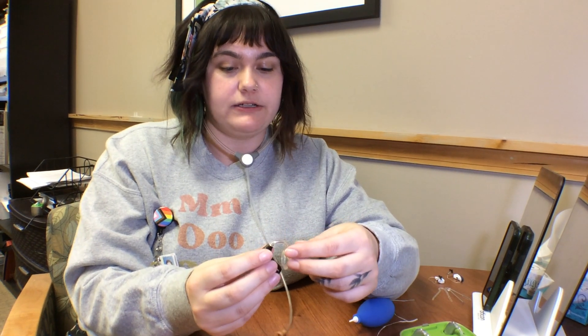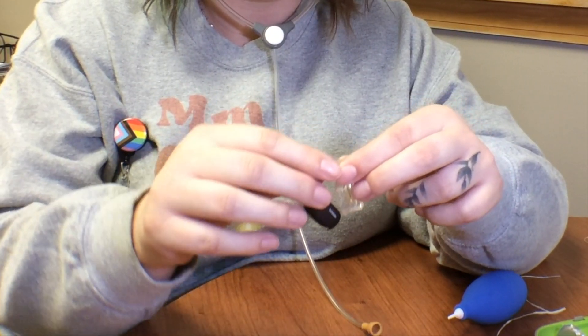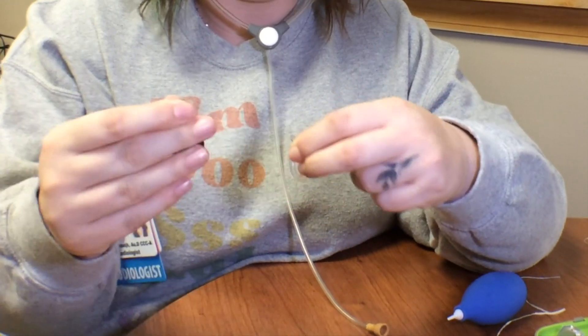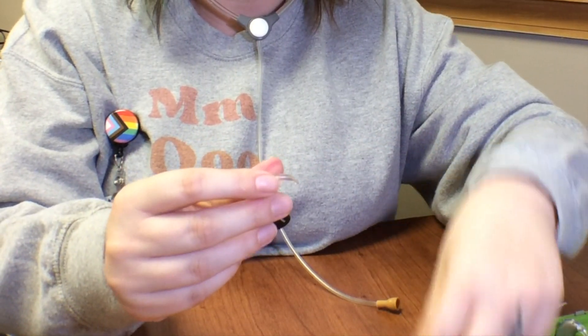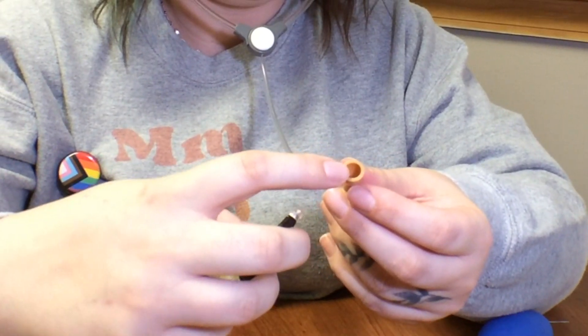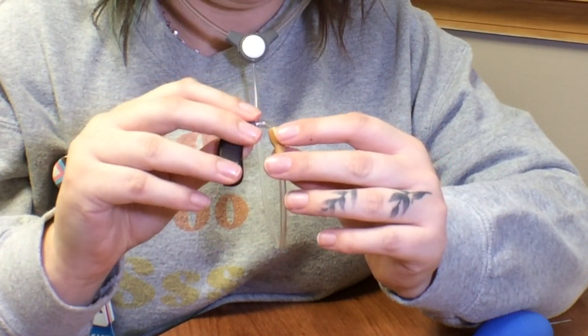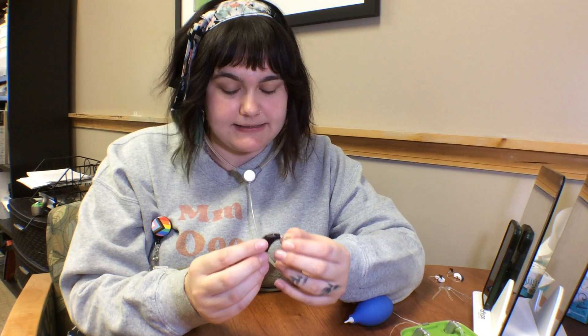The next thing to check is the tone hook connection. Take the ear mold off — usually just by pulling and wiggling a little bit on the tubing — and then put the tone hook down into the center part of the listener, again creating a good seal. You'll use those Ling6 sounds again.